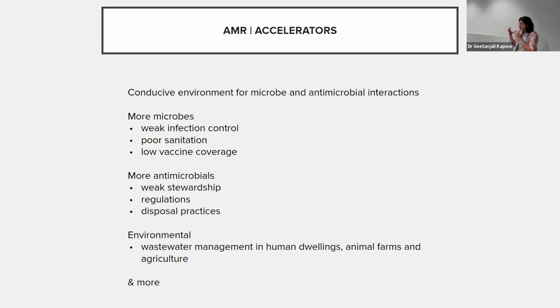In fact, even countries in the same region, like the Francophone countries, usually follow EUCAST, or there is the CASFM, they also follow that. But we should encourage that at least in the same region, they should adhere to the same kinds of guidance, again, for ease of comparability.